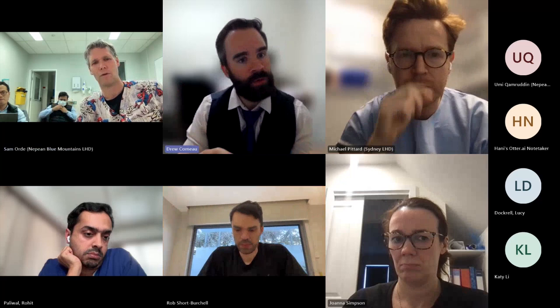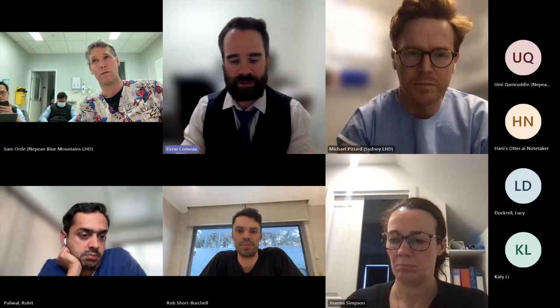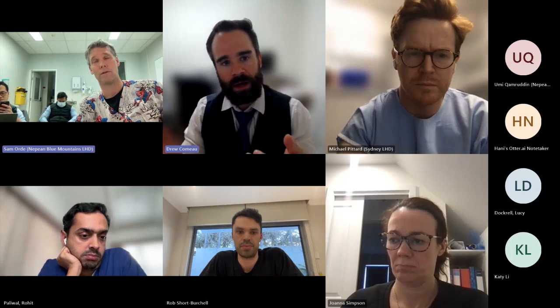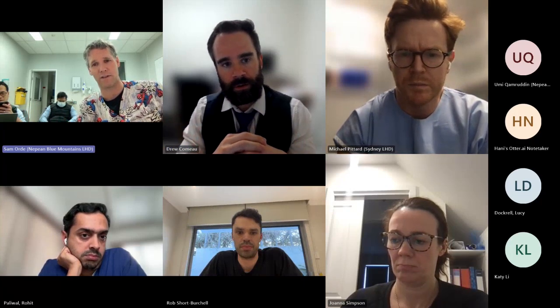You've used modes before, and what other modes would you use? And that's like your 2D color, CW. Yeah. Did I say that? Yeah, I think hopefully the other examiners have picked that up. That's exactly the kind of thing I'd get wrong.